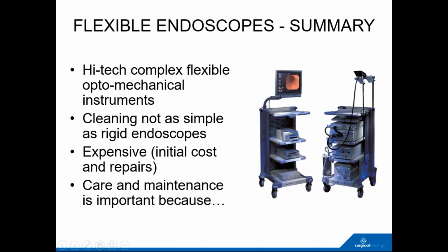But I mean, channel blockage is a pretty standard one. So what would that be? Brushing? Would that be a sort of brushing technique, or using the correct brushes to clean those? Yeah. And obviously another one which we haven't spoken about at all is if your washer disinfector breaks down, that can cause huge problems. And again, they're mechanical things. They've got nasty chemicals in them.